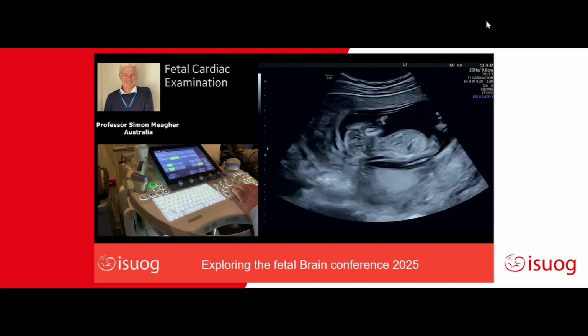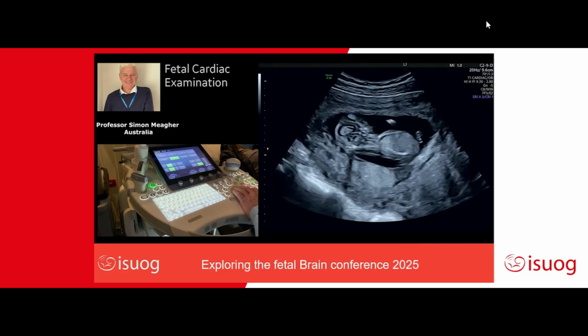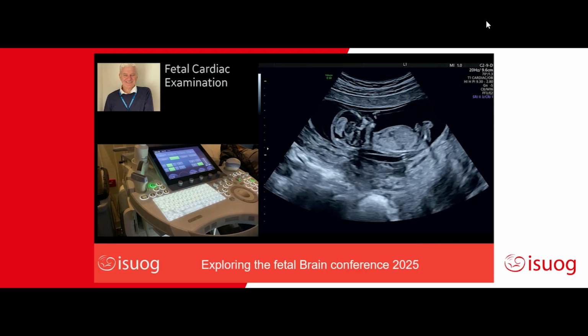And that's it really as a cardiac assessment in one go. I think that's probably enough on the timing of things, and I just might stop the examination there.